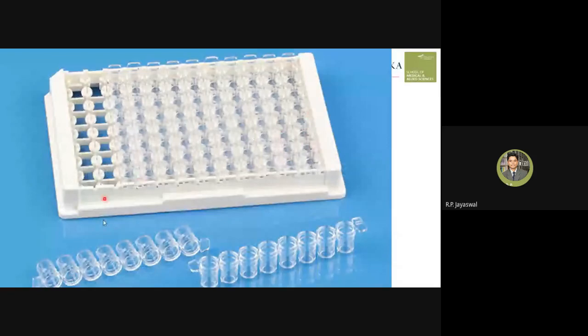One strip of microwells contains 8 wells: 1, 2, 3, 4, 5, 6, 7, 8 wells, and there are 12 rows, so 8 times 12 is 96. So this holder can hold around 96 wells.